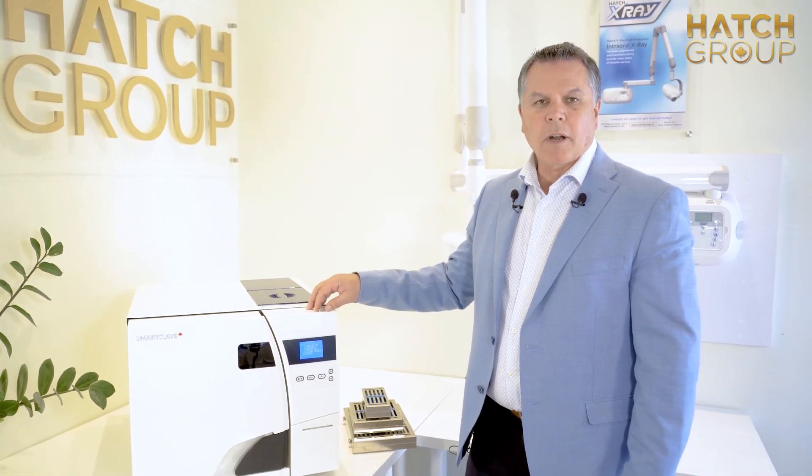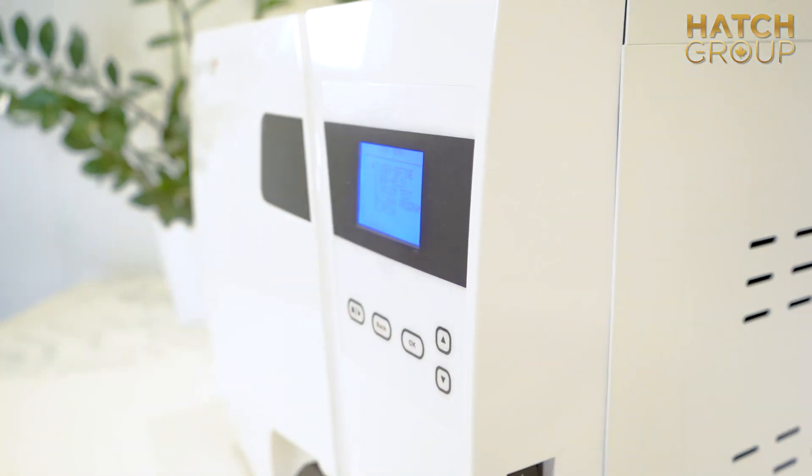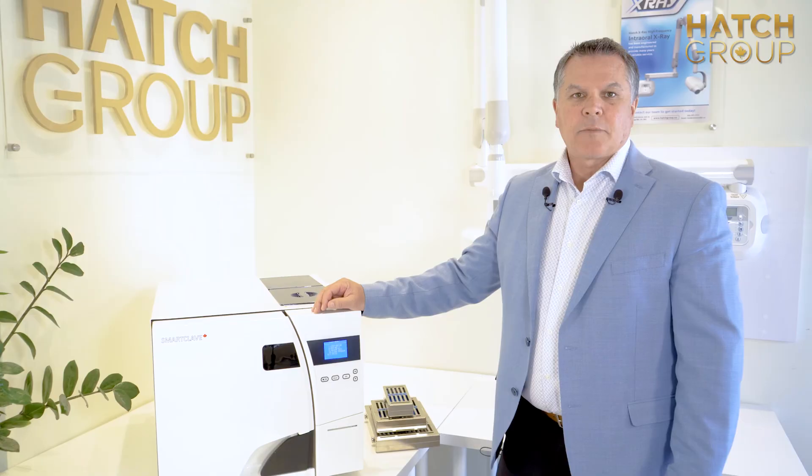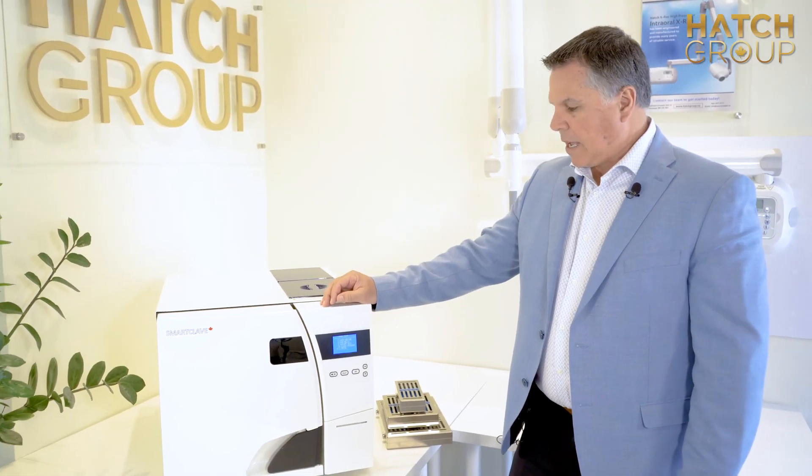Today I'd like to introduce you to the SmartClave. The SmartClave is a Canadian-made autoclave Class B. It has pre and post vacuum, and has some great features that I'd like to show you today.